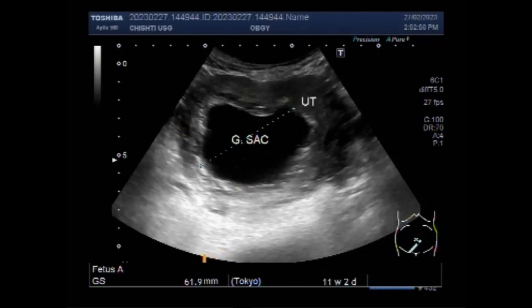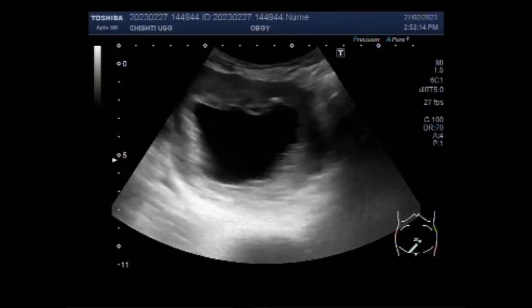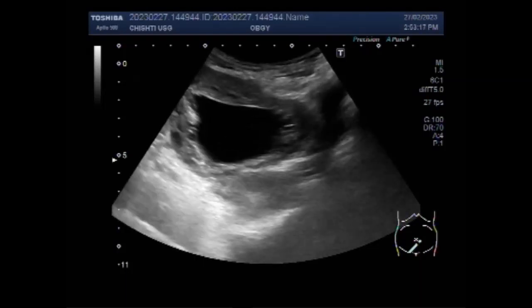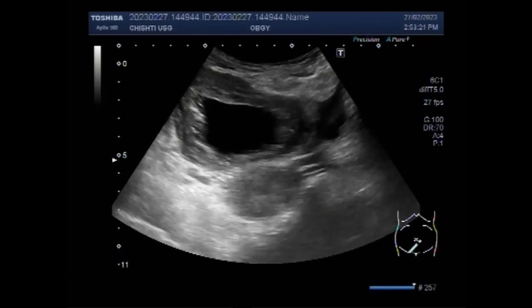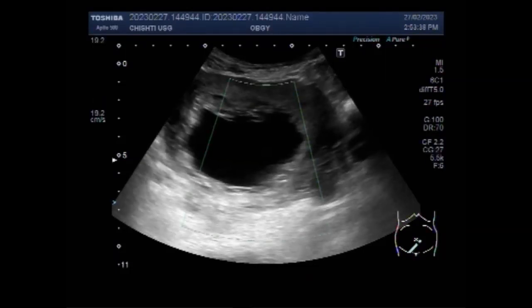Blighted ovum is usually identified at 6 weeks with transvaginal ultrasound and at 6.5 weeks with abdominal ultrasound. However, it is not unheard of for the fetal pole to be invisible until about 9 weeks. The general recommendations are to wait 2 weeks if we only see a gestational sac, and at least 11 days if a gestational sac or yolk sac is seen without a fetal pole. Most sonographers prefer to wait 2 weeks for the next ultrasound in both scenarios.